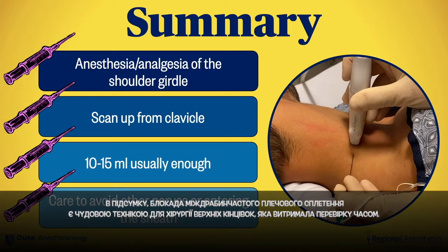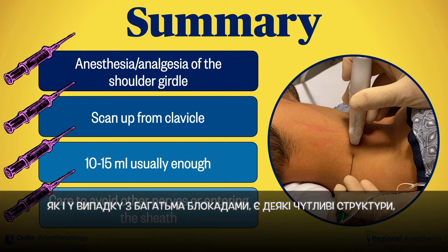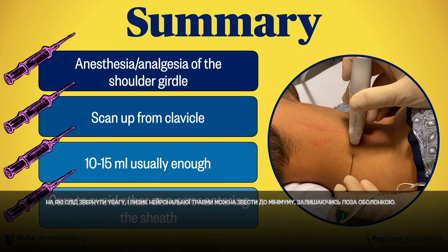In summary, the interscalene brachial plexus block is an excellent technique for upper limb surgery that has stood the test of time. It can provide standalone surgical anesthesia for shoulder and upper limb procedures and is our go-to for postoperative analgesia in shoulder patients. As with many blocks, there are some delicate structures to look out for, and the risk of neural injury can be minimized by staying outside the sheath.